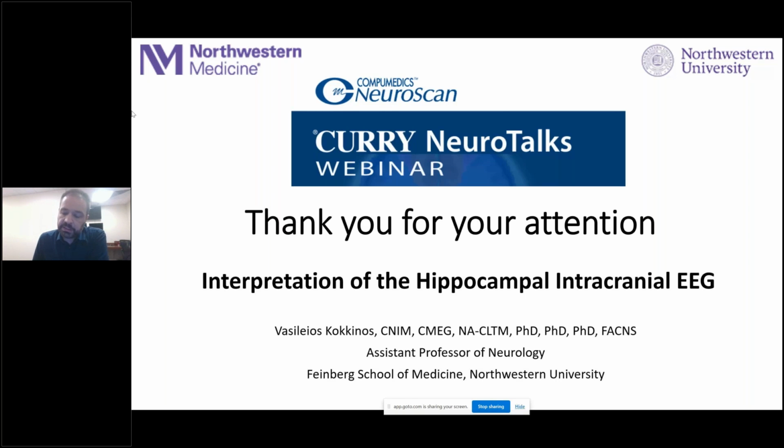I haven't. Usually the clinical amplifiers have a low frequency filter of 0.5, so we cannot appreciate the sub-delta frequencies very well. So I don't have much experience of that, but it would definitely be very interesting to see their distribution in the intracranial EEG of the hippocampus. That would be a great project.